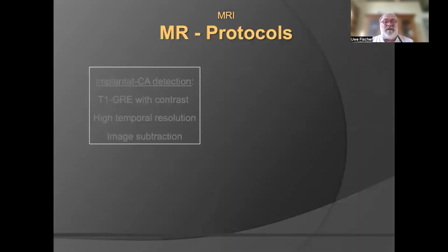How about the protocols? We use special protocols to look for complications of implants. So one protocol we talked so much about was the protocol to detect breast cancer.